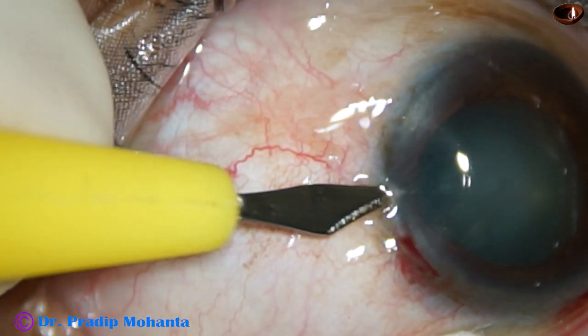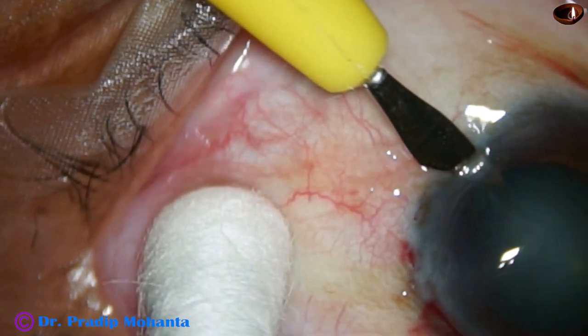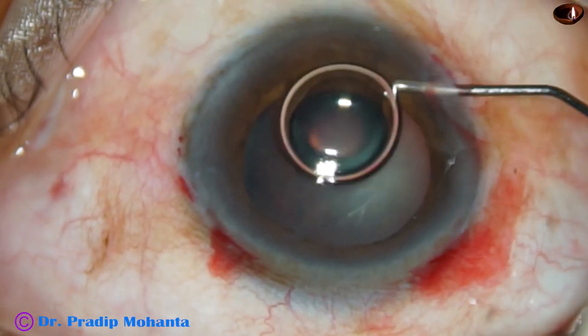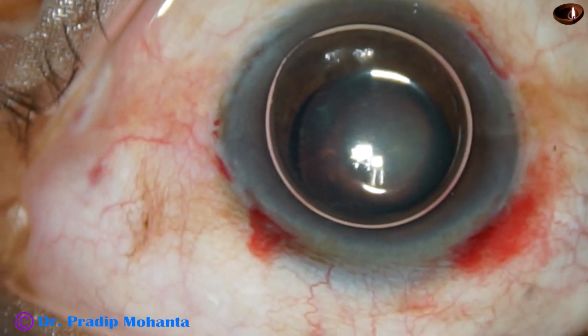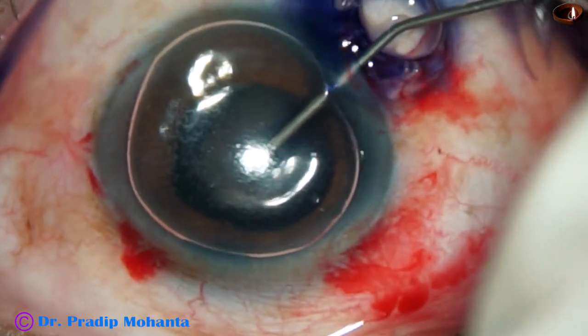Two stab incisions for application of iris hooks. An air bubble is injected. Trypan blue dye is applied over the anterior capsule.